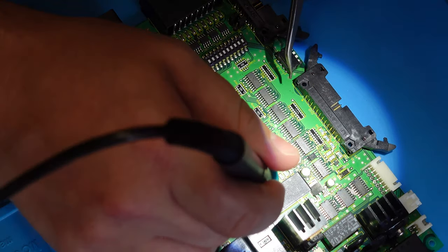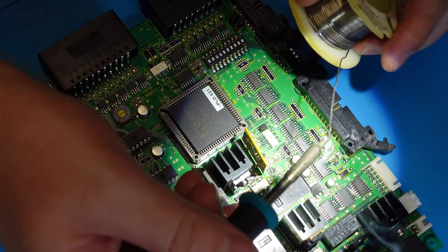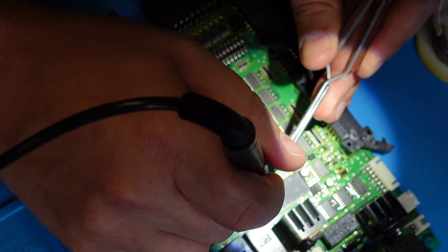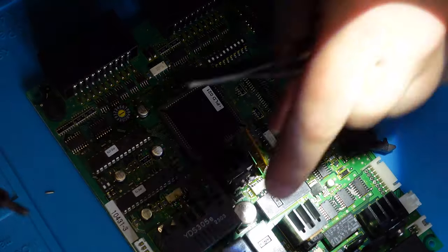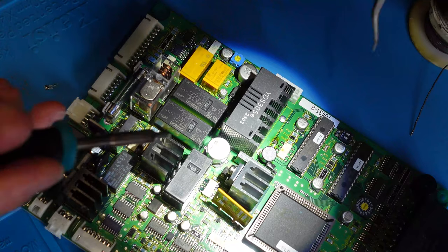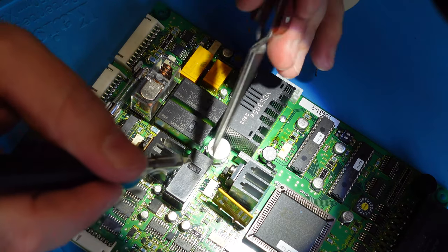That should be all she wrote. All right, let's put some more solder on there. Make sure it's down. It feels like it's down pretty good now. Okay, there's one, there's two, there's three. All right, we're on a roll now. Side. Okay, gotta clean my tip. Get some more.